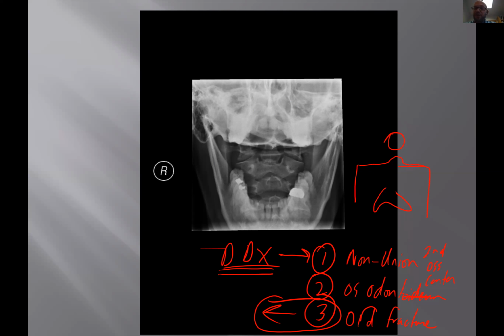If you have a flexed spinal segment, that could be old trauma. That's kind of a duh, but there's some recent research that's coming out that's proving that, and that's kind of fun. An os odontoideum is typically an old type 2 Dens fracture, and unilateral sacroiliitis is infection until proven otherwise.